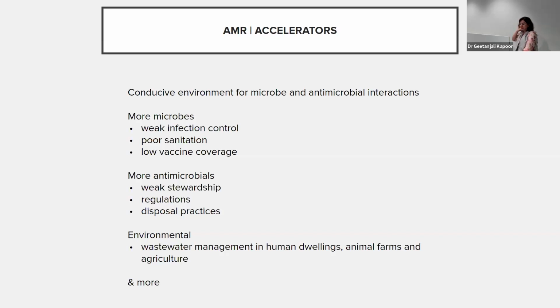So we do encourage that the labs should always comply to international guidance and standard practices, whether you follow CLSI or EUCAST or any other, the labs must follow some guidance.